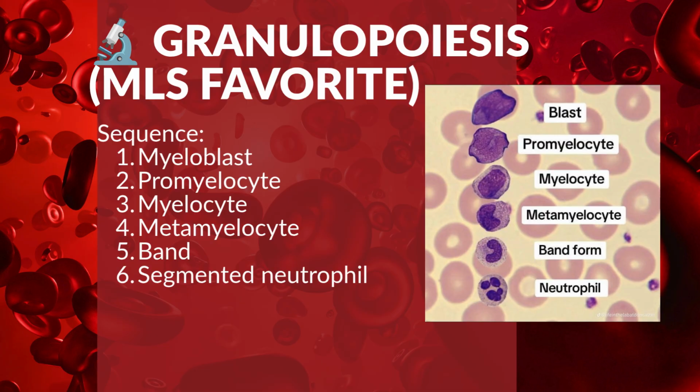At this point, the cell is committing to becoming either a neutrophil, eosinophil, or a basophil. This is where it's going to tell us what it's going to be. I'm picking my specialty at this point. The nucleus becomes more condensed and the nucleoli disappear. Because guess what? Do you see an eyeball? Cyclops has retired. The myelocyte's first specific identity.